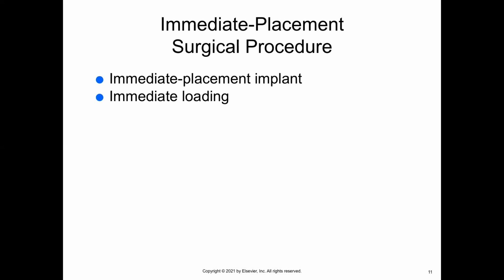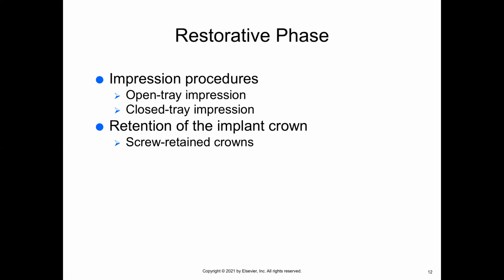Implants can be used to support partial or full dentures as well. Examples of this would be the all-on-4 or a snap-in denture.